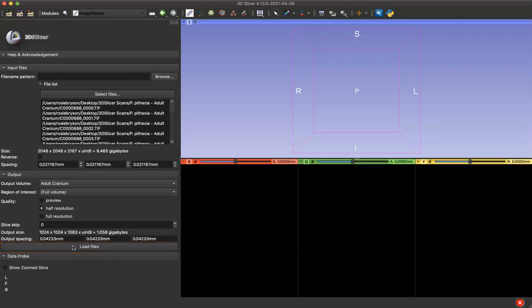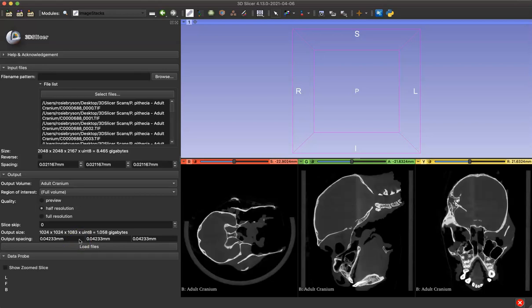Depending on the size of your data, this might take a little while to load, so I'm going to skip ahead here. Now you can see our data is loaded into Slicer.